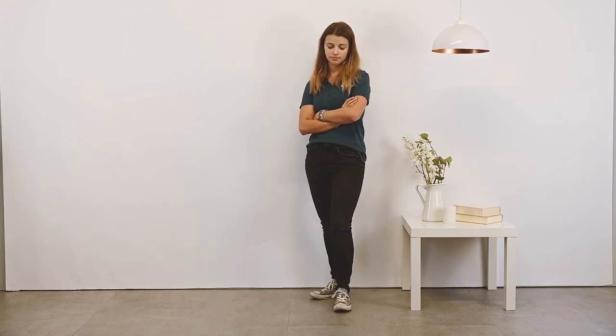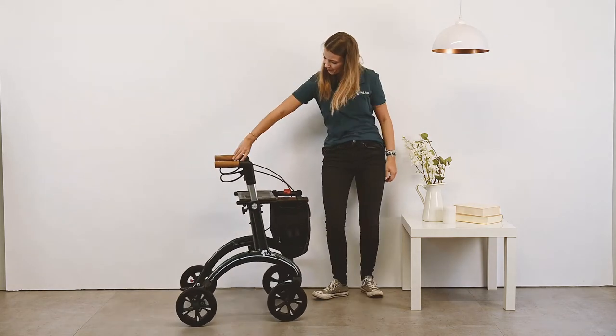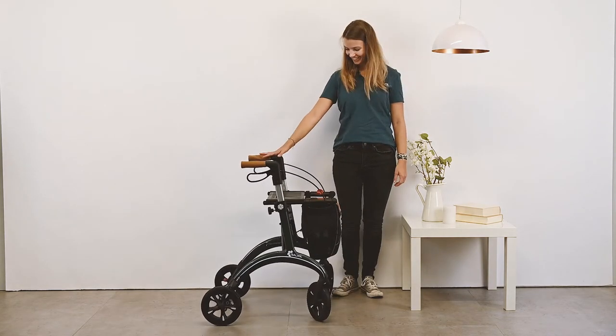You need a rollator, but somehow they all look the same. You want something stylish and safe? The carbon rollator from Saljol has a lot of advantages and features.